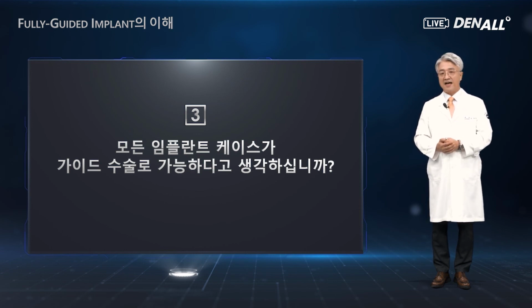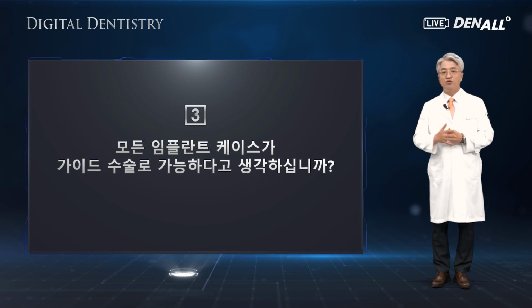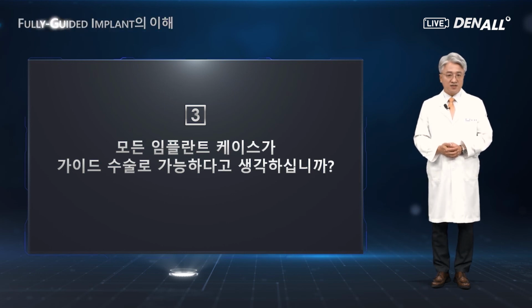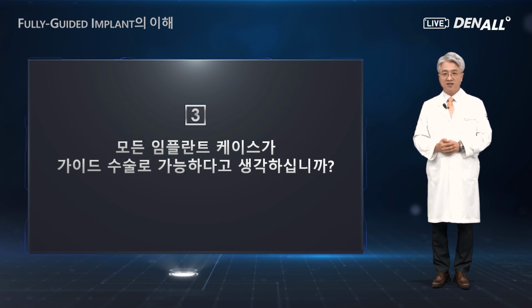So the guided surgery simulation is used for all those, and the guide systems and the drill systems are available to do all the planning and actual surgery as planned. Therefore, I believe the guided surgery can be used in simple or very complicated cases to make the cases more complete. The guided surgery system can be used for all such cases. I can say that with my confidence.